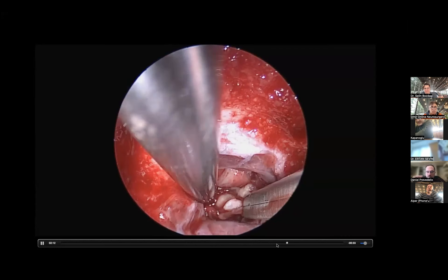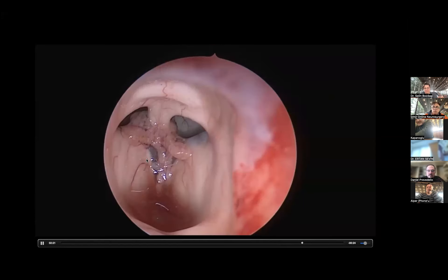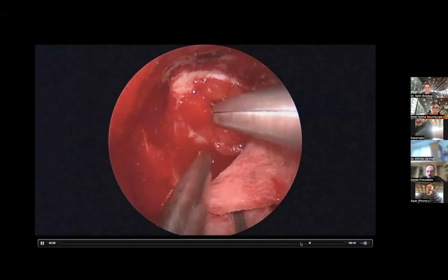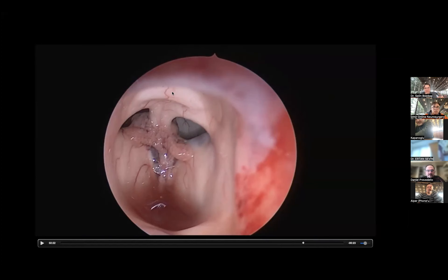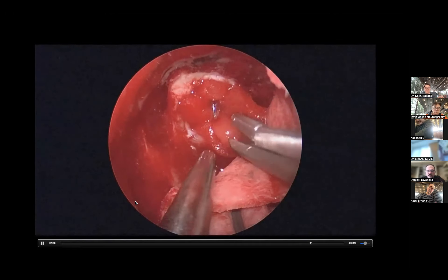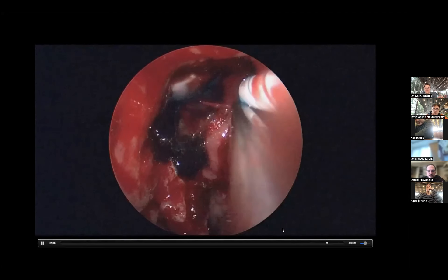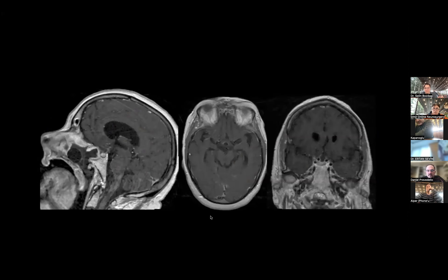This surgery was interesting because we dissected between the stalk and the optic nerves anteriorly. Using blunt dissection, I created a 360-degree plane around the tumor until it was free from the stalk and optic nerve. Looking inside, it was free and extended in front of the stalk between the chiasm and stalk all the way to the third ventricle. At the end we had beautiful views of the ventricle from below: anterior commissure, foramen of Monro, choroid plexus, and vellum interpositum visible. No damage to the hypothalamus — just a little petechia from tumor contact. The patient's function was preserved and the hypothalamus did well.